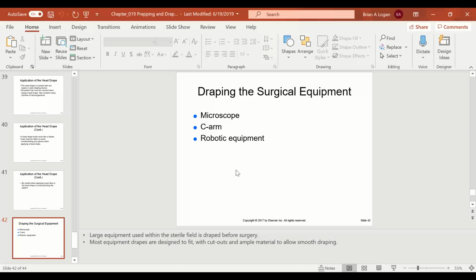So for Katie and Taylor, Liz and Valeria, the people on the shorter side, I would definitely be on the lookout and having your circulators remember to bring that down for you when you're draping. The C-arm, unfortunately, can't really go down that far, and with the robot, everything's going to be kind of in front of you, in a horizontal pattern rather than a big vertical reach up pattern.